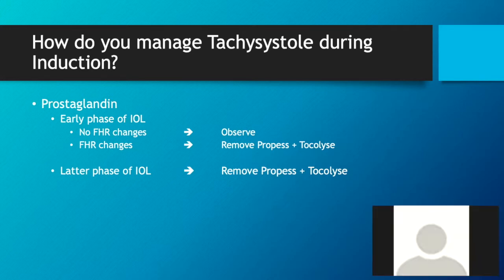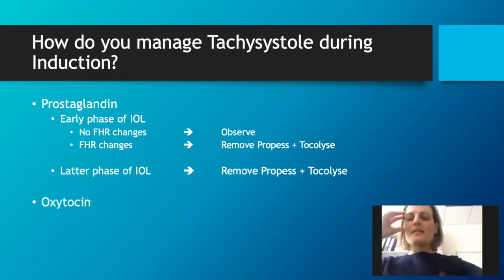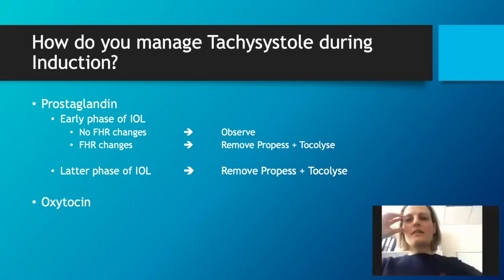Now, just to make a pause and a clarification about this discussion. We said, and you agreed, that if you have hyperstimulation, you stop it.